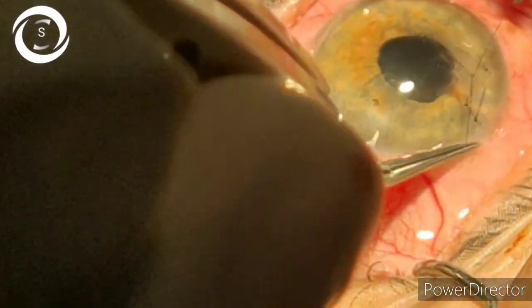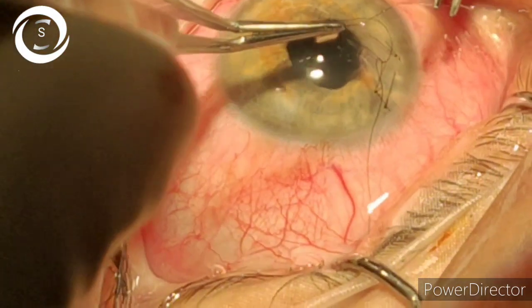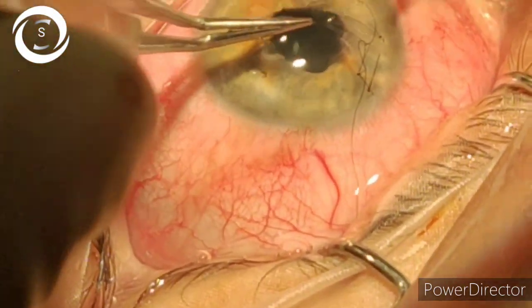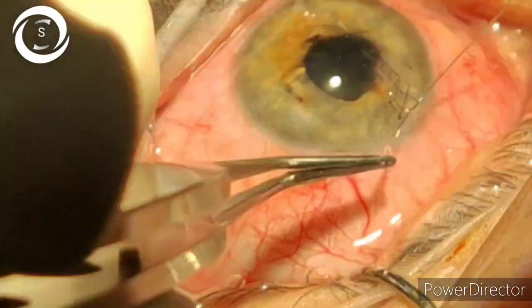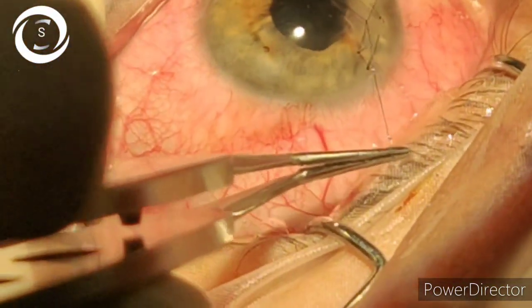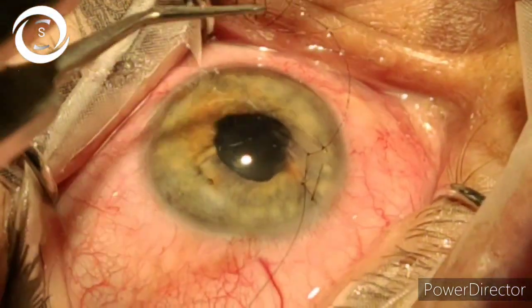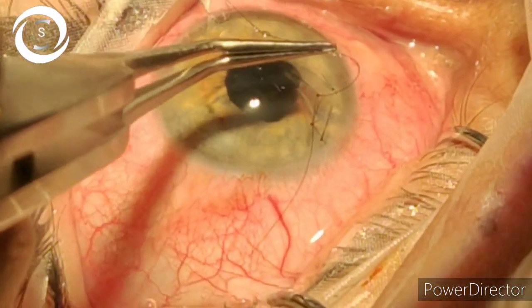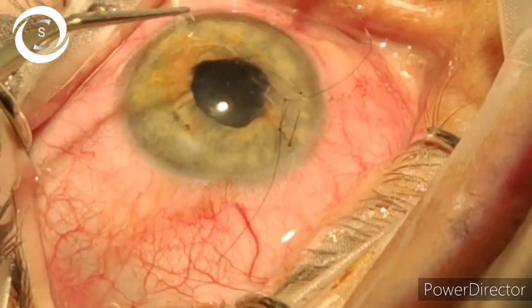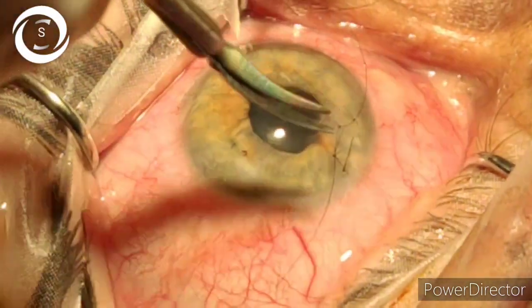After the initial patient movements, the patient is now cooperating. One of the assistants is constantly instilling topical proparacaine 0.5% drops. You can see that such clean and small corneal tears can be repaired under topical anesthesia, avoiding the complications of both local and general anesthesia.